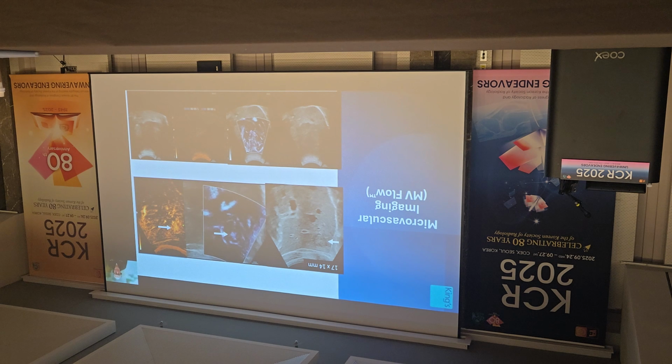And these two examples of an epithelioid HCC and a focal nodular hyperplasia in an atypical liver show you that you can get very clear vascular pictures of the lesions and look at the internal structure. But you can see it's very movement dependent, and any improvement on this in your assessment of the underlying focal lesion will be very beneficial to your interpretation, and also it will make the examination more speedy and efficient.